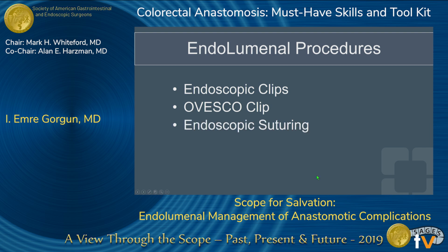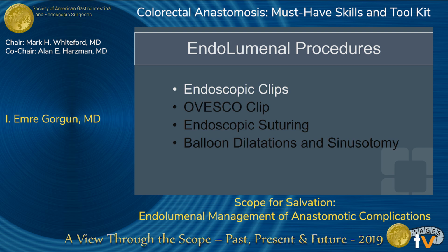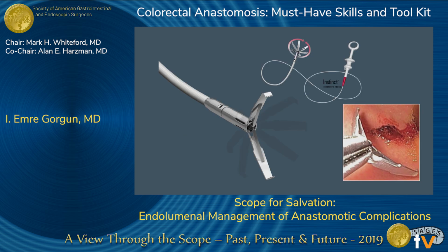Clips, over the scope clip is another one. Endoscopic suturing, balloon dilatations, and sinusotomies are some of the methods that I will touch base on today. So first, clips, we are all pretty much familiar with that. Single resolution clips, many companies have these.